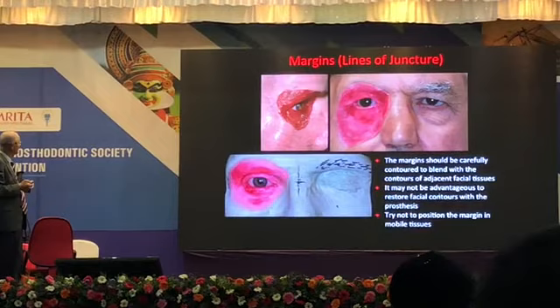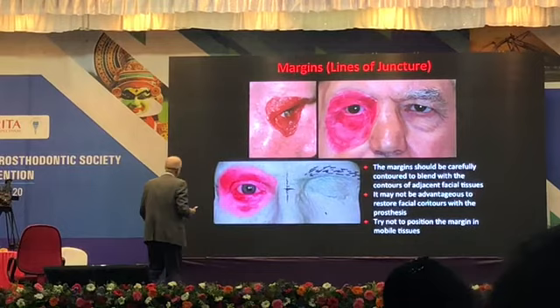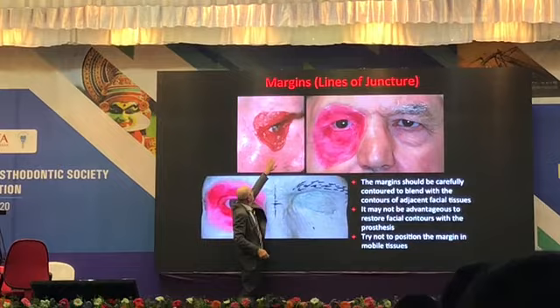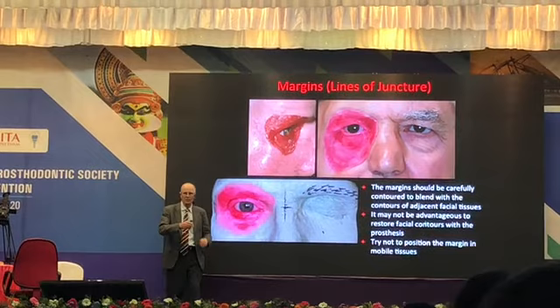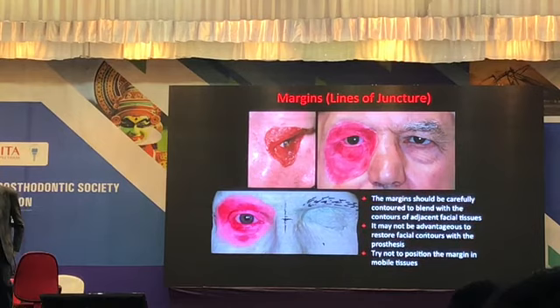Now, the purpose of these slides is to show you the way the periphery is blended into the contours of the skin. There should be a nice, smooth transition between the contours of the prosthesis and the skin. There should not be an abrupt change in the contour. This should smoothly flow into the contours of the adjacent skin.